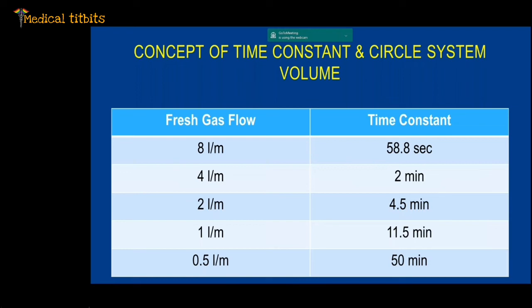So your patient is going to take more time to go under if you're using very low flows. If you're using very high flow, then the patient obviously will go under much faster. The principle behind that is the time constant.